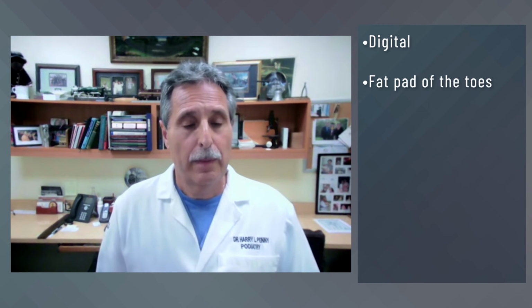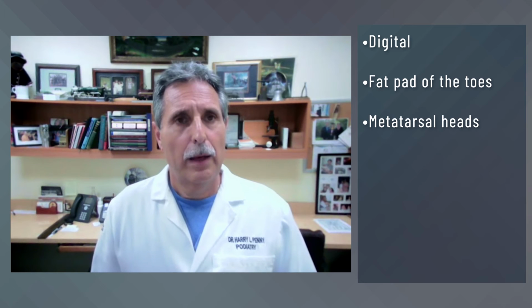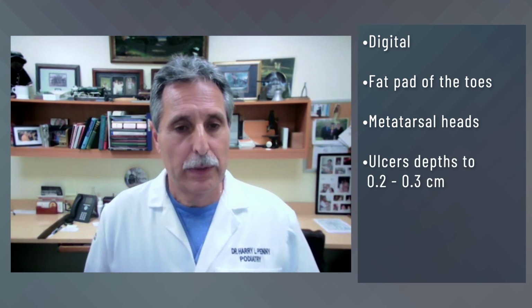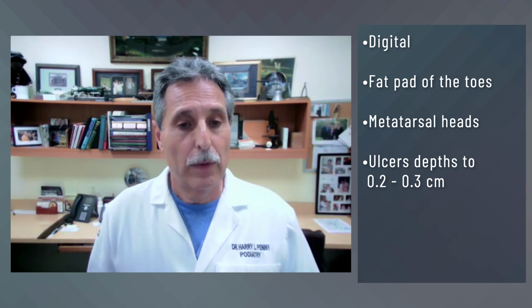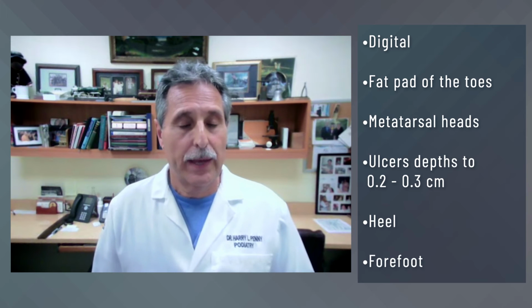Harry and some of the docs that use these have gotten some pretty darn good results with some patients with some of these feet that give us real challenges and won't go into a cast. So the bottom line is I like it on the digital wounds, the fat pad of the toes, underneath the metatarsal heads. It works very well, as long as it's not a deep wound where you can see the joint capsule or the tendon. And it works well for shallow wounds on the heels. We've had very much success with that as well.